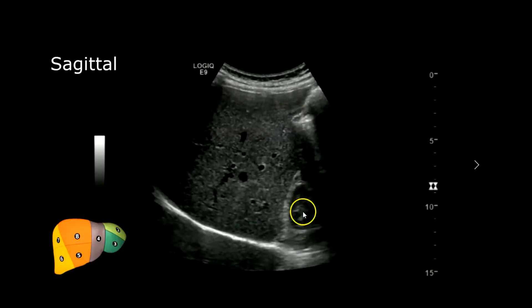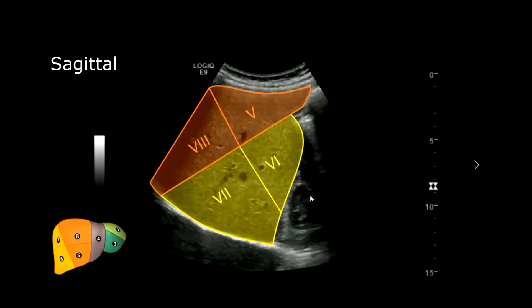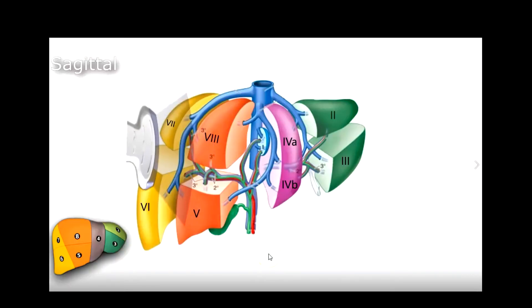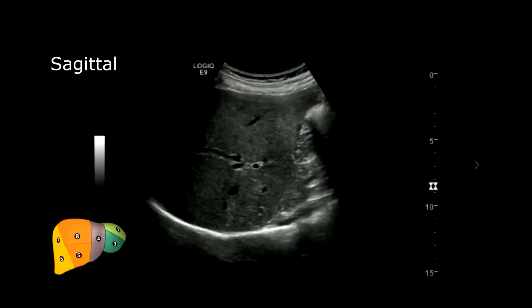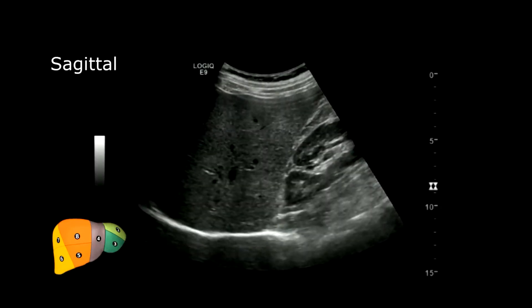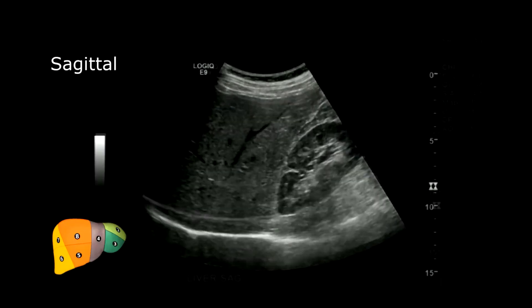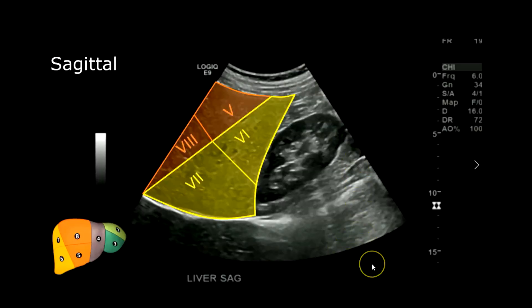Moving further laterally, you start to see a little bit of kidney, with segments 5, 8, 6, and 7 visible. All the way laterally you have the kidney and segments 5, 6, 7, and 8.